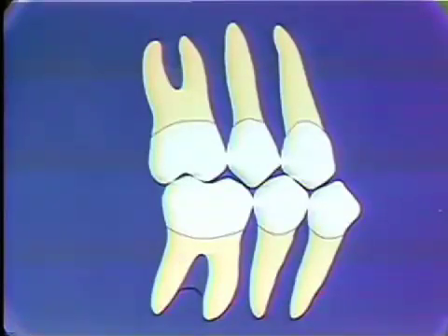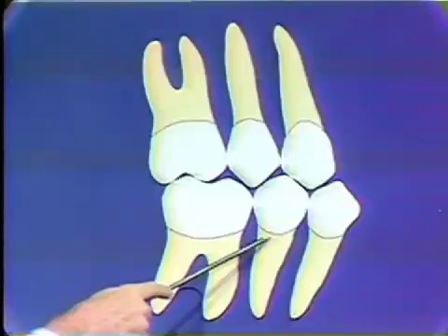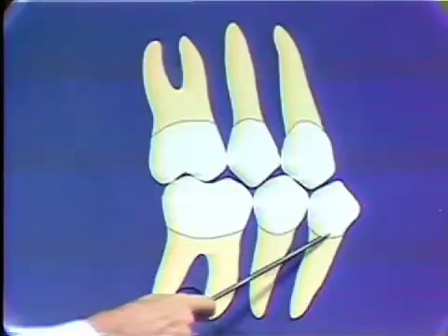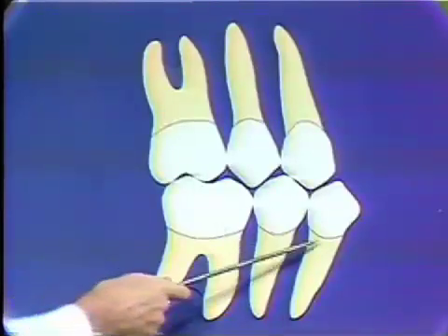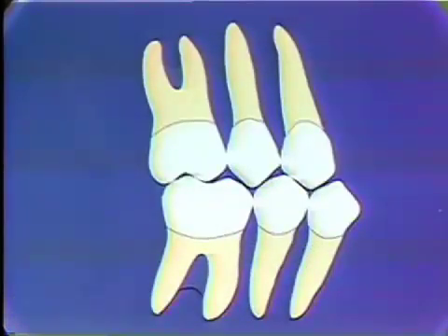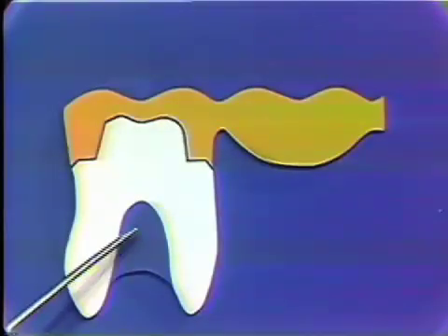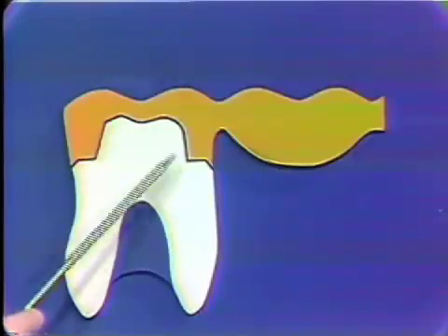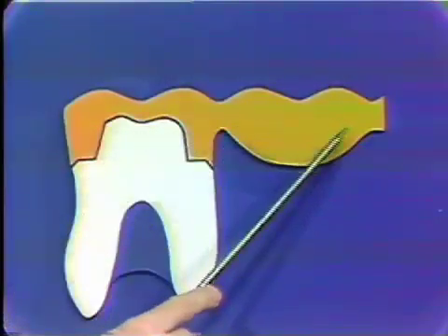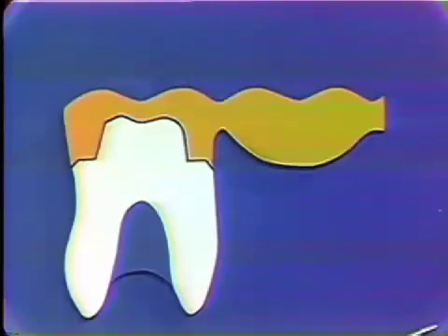So with that recognition of the types of movement that take place in the teeth, let's see what happens if this tooth was missing and we placed a retainer on this one and put a fixed bridge between these two teeth. We would lock together two teeth which had been previously able to move independently. This is the mandibular molar that we were looking at, in which a bridge retainer preparation has been cut here. And this represents the bridge running along here to another retainer on the bicuspid, which for simplicity is not shown in this diagram.